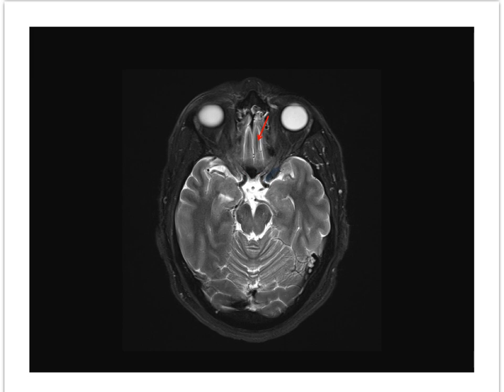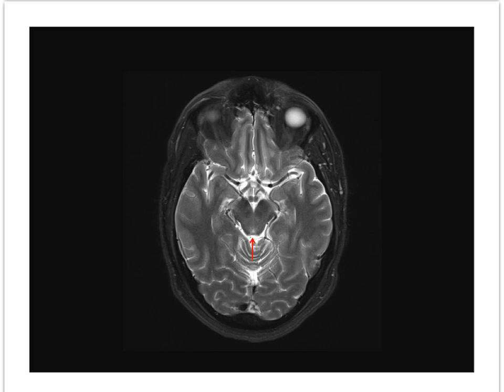Here is the gyrus rectus, beneath which lies the olfactory bulb and tract mediating smell as cranial nerve 1, just above the superior nasal cavity — a relationship better seen on the coronal. At this level we have the quadrigeminal plate cistern at the level of the inferior colliculus.